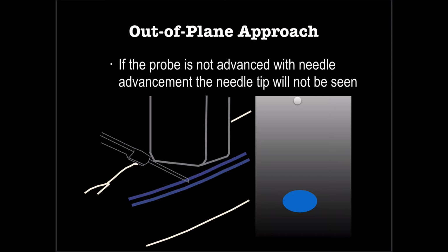Now, I don't recommend aspirating when you stick a needle in something. I recommend you visualize your needle. But if you were aspirating, you might get into the vein and get a big flash of blood and know you're in the vein. But more than likely what will happen is your needle will keep on moving even though you got that flash of blood and you'll go through it.